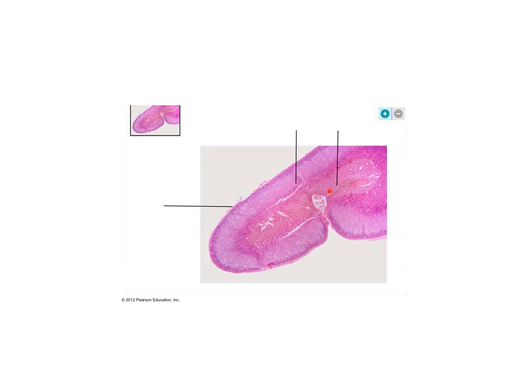And then the very center, where we see a lot of blood because there's a lot of blood vessel capillaries located in this area, this is the adrenal medulla. So the adrenal medulla is in the middle. M for middle, M for medulla. It produces hormones known as epinephrine and norepinephrine, which are part of your sympathetic nervous system to put you in the fight or flight mode.